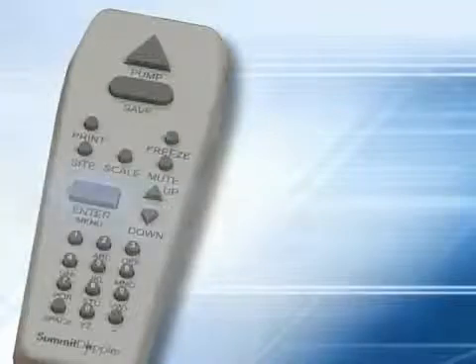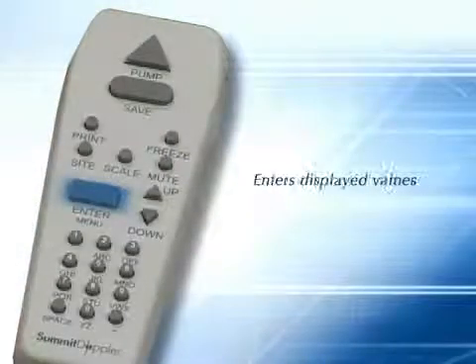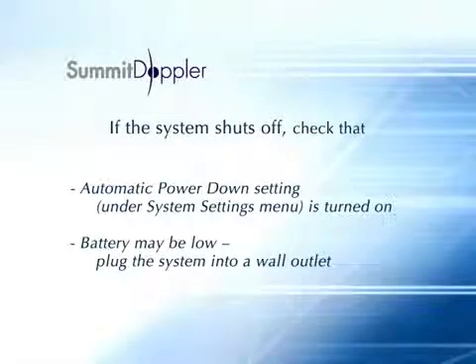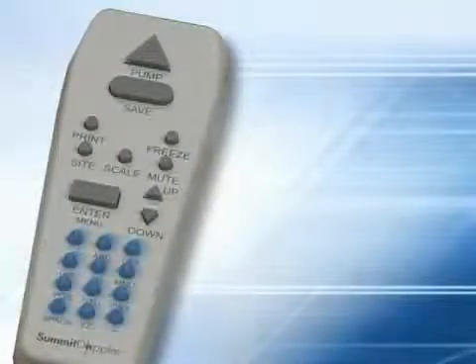The enter menu key opens the options menu, enters displayed values, and selects menu options. The up and down arrow keys adjust pressure values prior to saving them in the system and also allow you to navigate through menu selections. The number keys are used for entering alpha or numeric names and values.